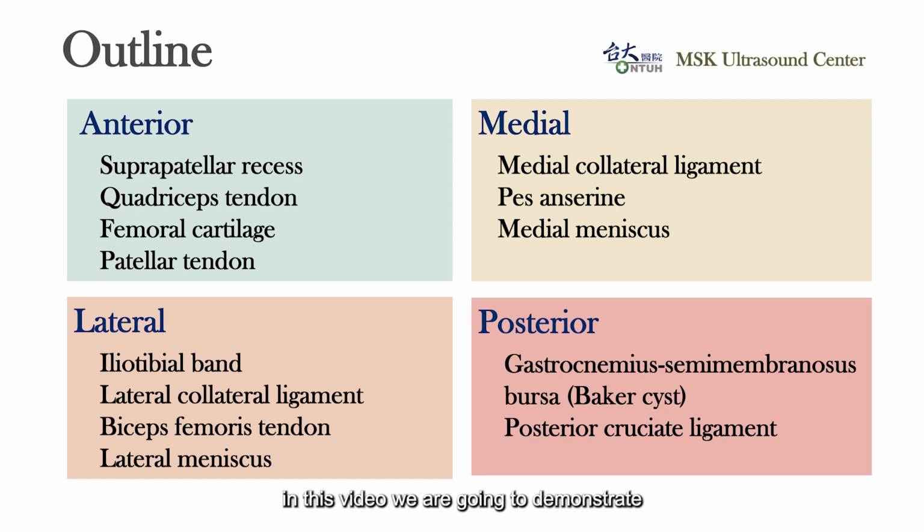Hi everyone, in this video we are going to demonstrate how to scan the knee joint by ultrasound. Here's a checklist for knee ultrasound examination. We will separate the knee joint into 4 parts, including anterior, medial, lateral and posterior parts.